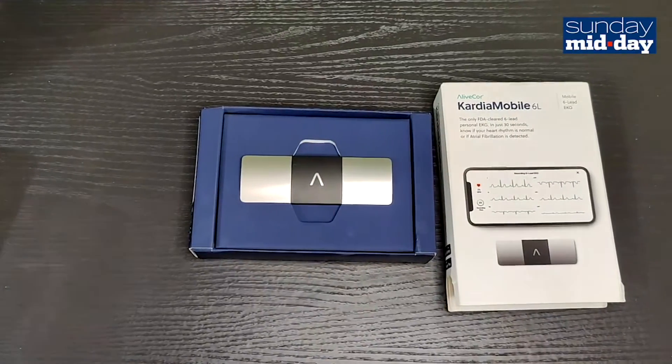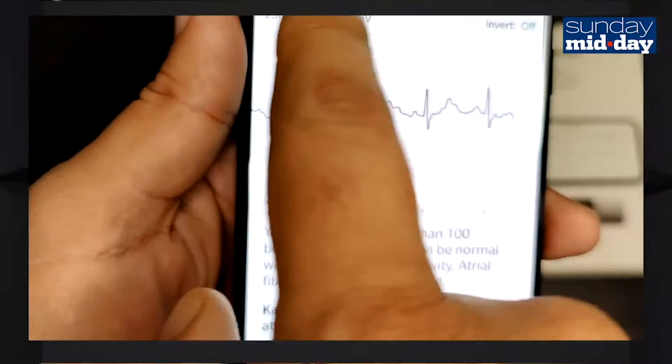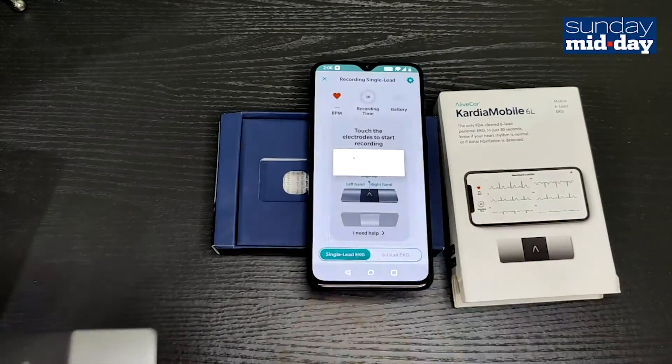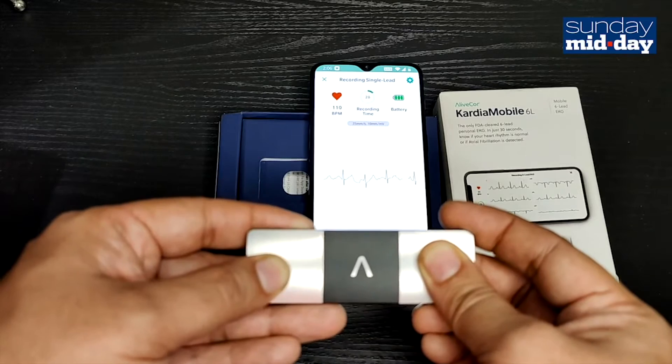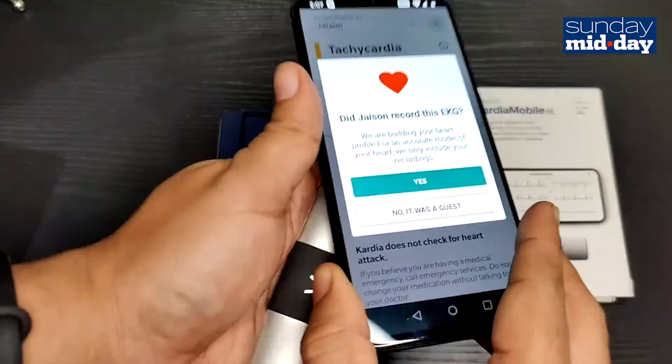With the 6-lead version, you can take two types of readings. The first is a single-lead reading — it should be noted that the single lead is less accurate than the 6-lead one. To take the reading, you select 'Record your EKG' on the app, then place one finger on each of the two metal leads on the top. The device will then record your beats per minute and check if your heartbeat is regular.